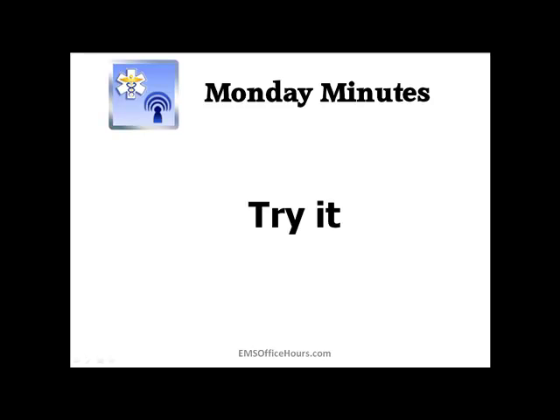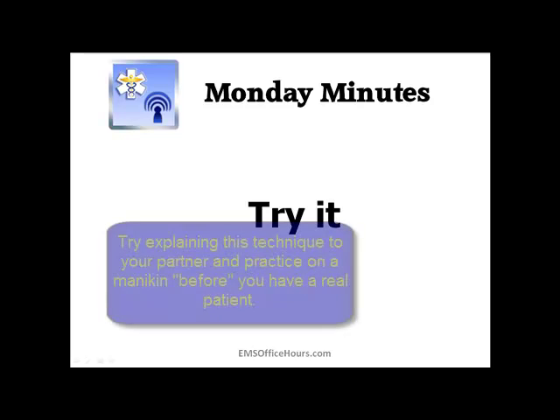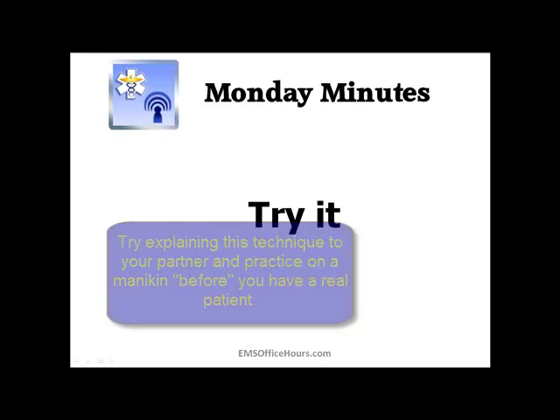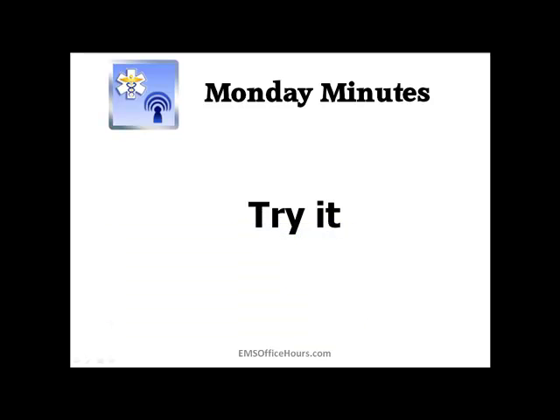Of course, you can't do this all on your own. It's going to take more than just two hands, but if you're familiar with the procedure, you can manipulate the larynx into position and then have your partner hold that position as you pass the tube. Occasionally when you let go, it might shift just a little bit because they're not anticipating that pressure, so just adjust it a little bit to bring the cords back into view for you, and then pass that tube. Of course, check lung sounds, and don't forget to confirm with end tidal capnography.